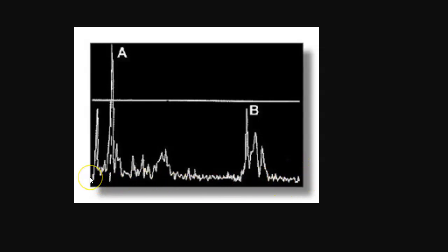And so this is a pulse sent in. It receives echoes until this point, and then another pulse would be sent in, and we would get more echoes. So both the A mode and the M mode are demonstrating temporal resolution of one scan line at a time, and that is their temporal resolution.